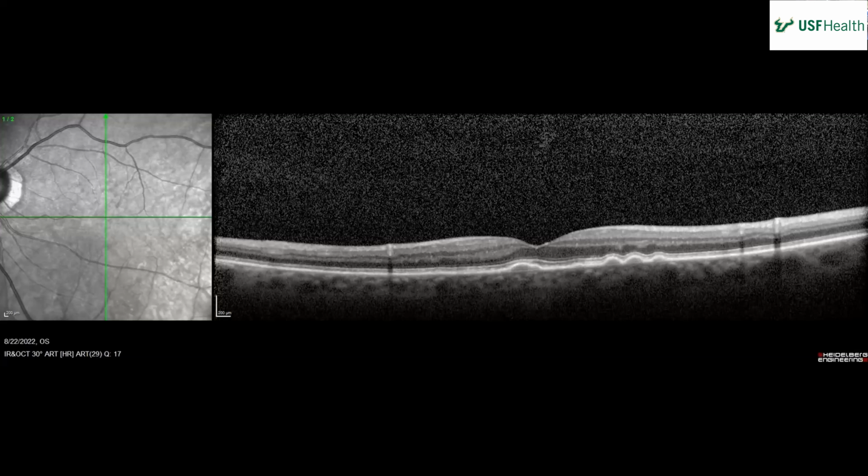Non-perfusion. Or no, blocking. Probably there's fluid. Yeah, you can sort of see a vessel almost going under it. It almost looks like it's obscuring a vessel. So that's blood. I just don't have a color picture.